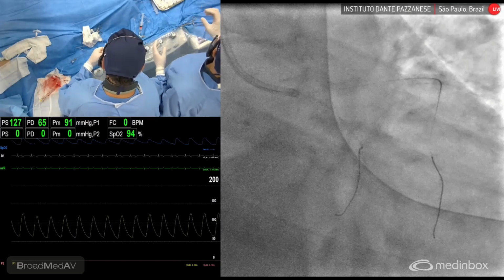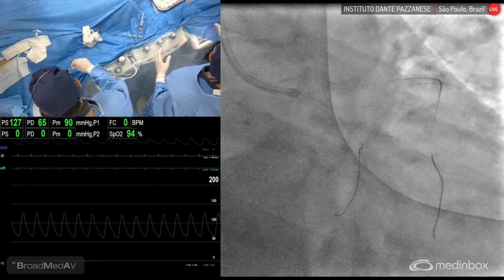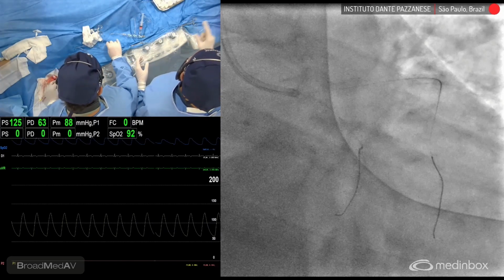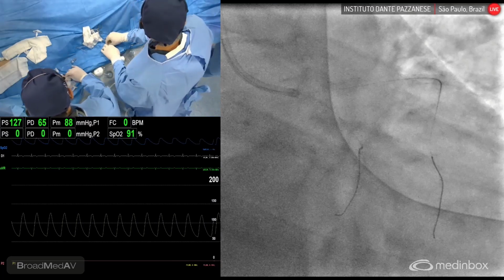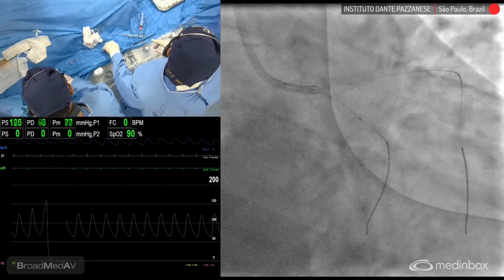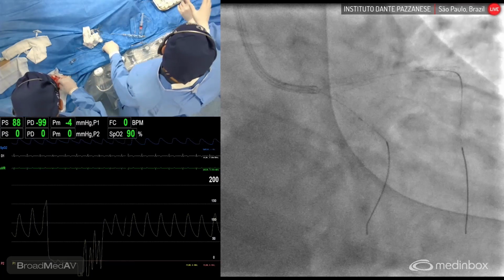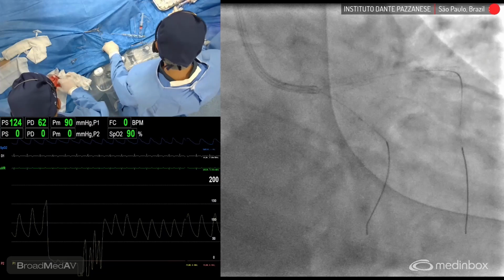In the picture on the left side, you could show the angio, and on the big screen on the right side, if you could show us the FFR, the physiology, please, the MFR. So instead of the angio, we want to have the physiology, please.